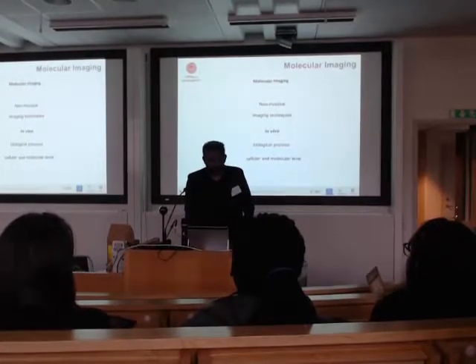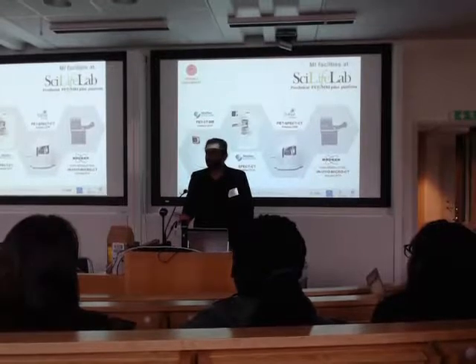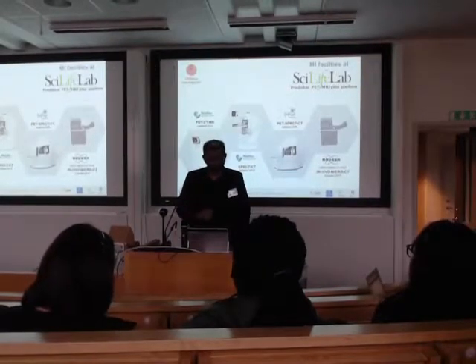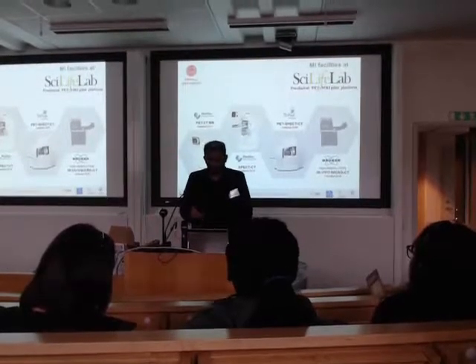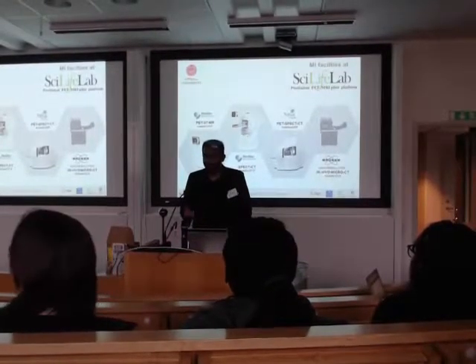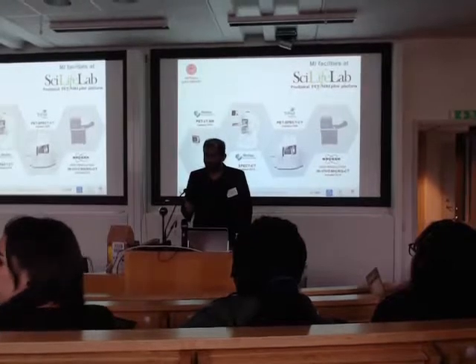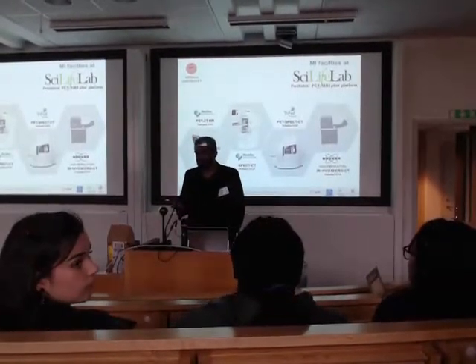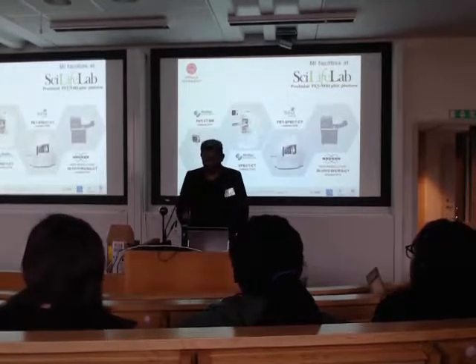So to do this, we have the following imaging modalities. We have the first of its kind, PET 3 Tesla MR, then a combination of SPECT CT, and then another instrument which is a combined facility of PET, SPECT, and CT. And we have a newly inducted system for micro-CT, that's generally for doing bone scans.